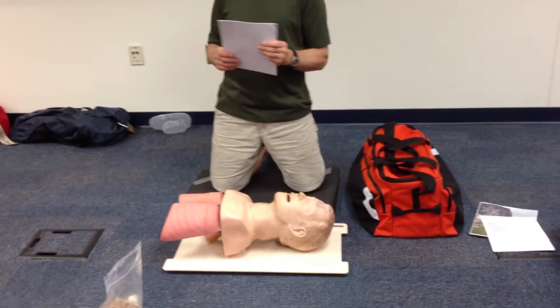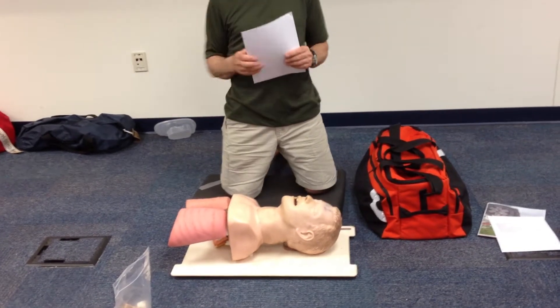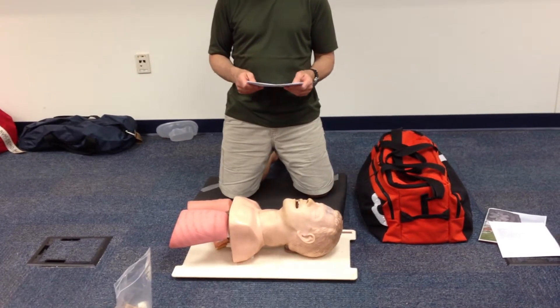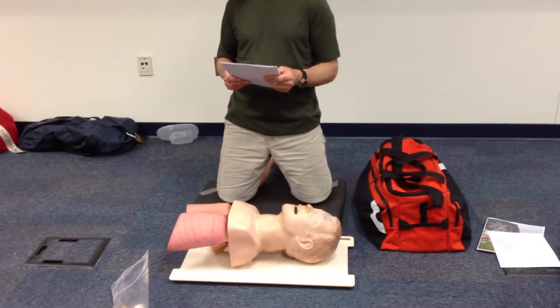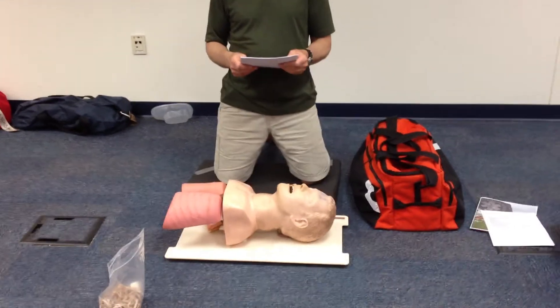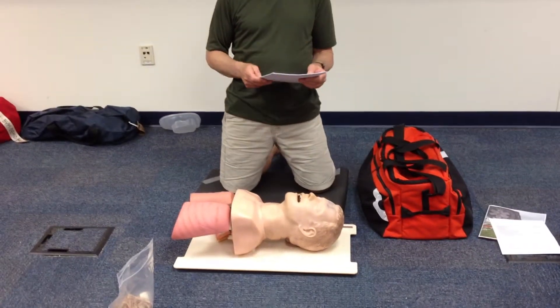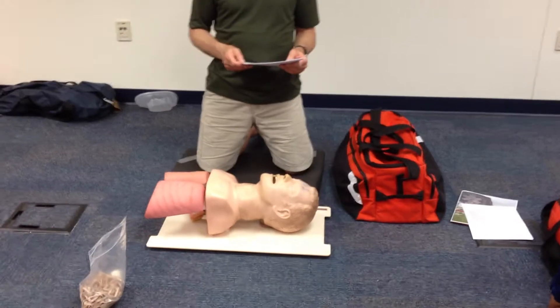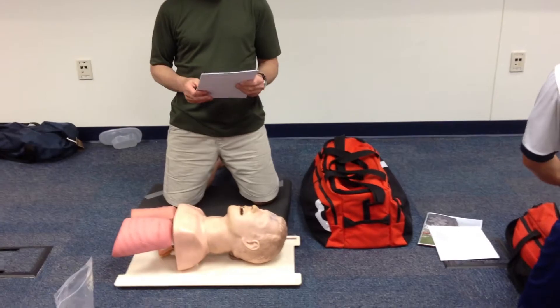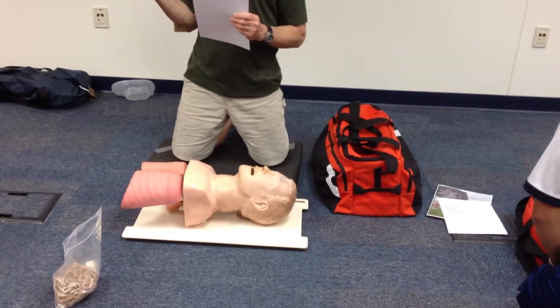Ready to go. Try not to leave your cylinder standing up all by itself. Check your PSI — Gavin, what's your PSI? Two thousand. Okay, great. And Sean, what's your PSI?